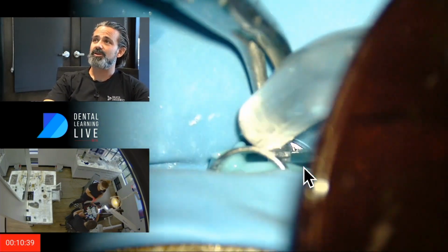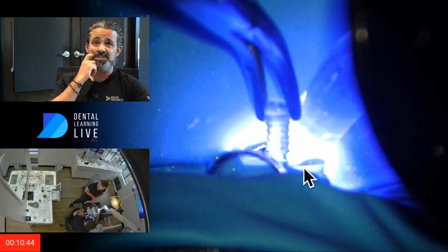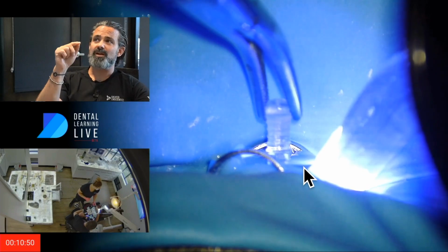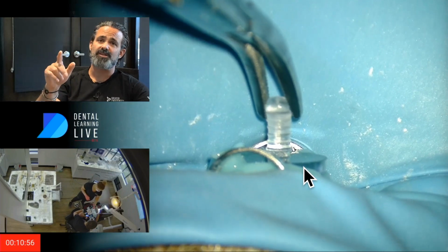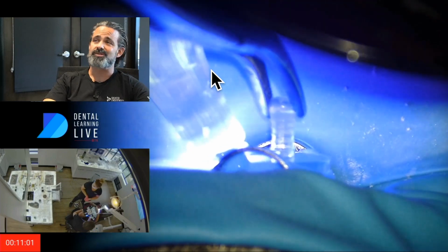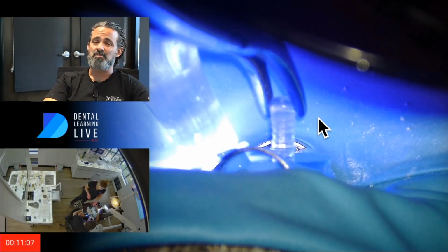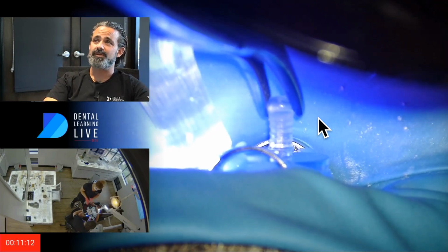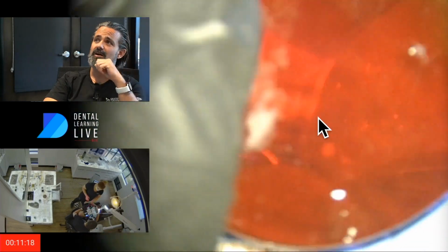So we get a little cure, and when I cure, by the way, I'm trying to do this looking at indirect. I actually don't mind touching the platform. I think the heat from the light is actually my friend. I don't want to bury it into the sound seal, so I don't want to touch that, but I have no problem touching the platform. And sometimes I wish that even my hemostats were clearer. If we had tweezers made of the same stuff, I could cure around it a little easier than with cotton pliers or hemostats. I just like the grip of the hemostats. I feel like I have more stability when I'm doing things left-handed. So that's why I use that over cotton pliers, but there are locking cotton pliers, of course.